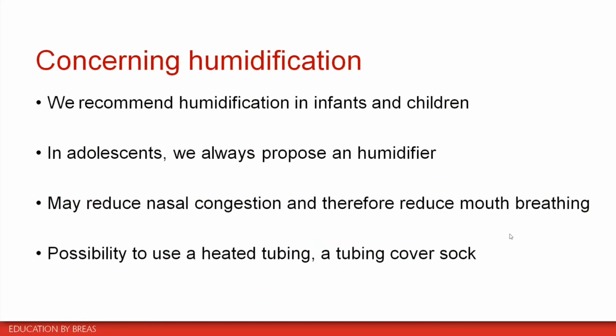This is considering comfort, but it can be very important, once again, to make the tolerance of CPAP and NIV better. And sometimes it can help to close the mouth. If you are using, for example, a nasal mask, just by having a very good humidification, you will allow a better ventilation through the nose, and the mouth can be closed just by adjusting correctly the humidification of the air.